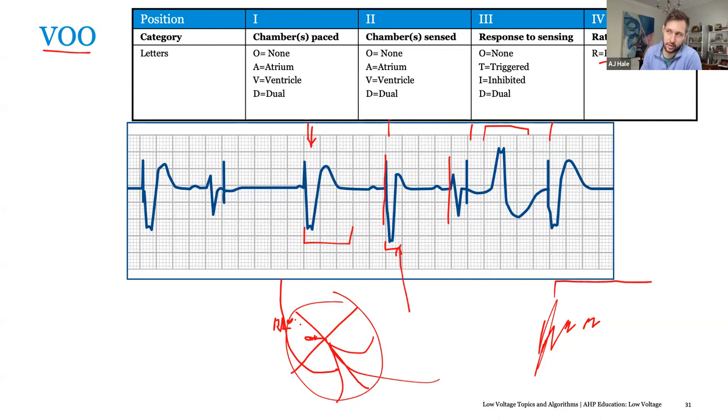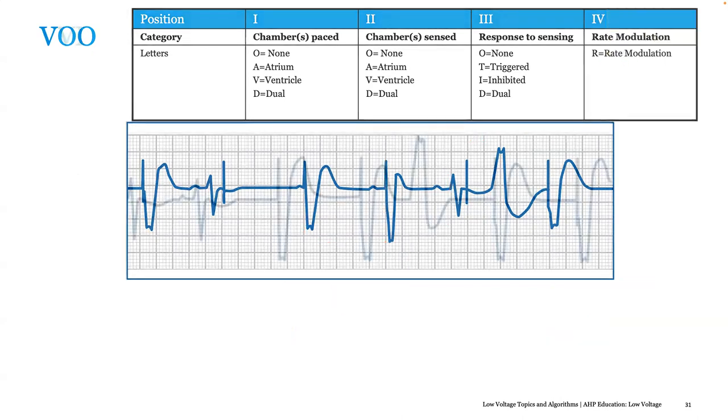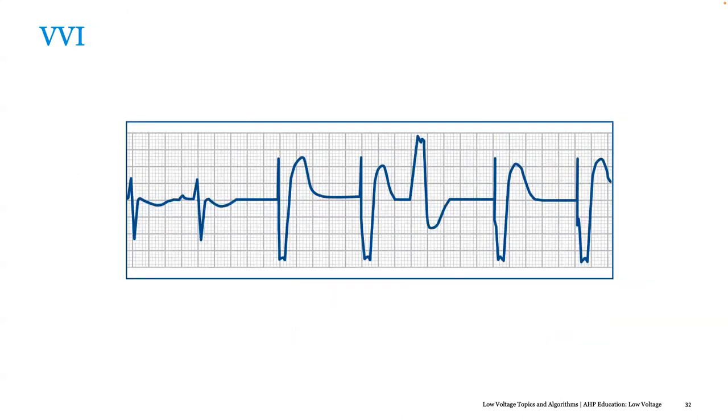Pretty straightforward. Yes. Cool. Yes, it does. But I have a question. Can I? Yes, sir. Ask? All right. So, in regards to lower rates, perhaps for surgery, you change to VOO.